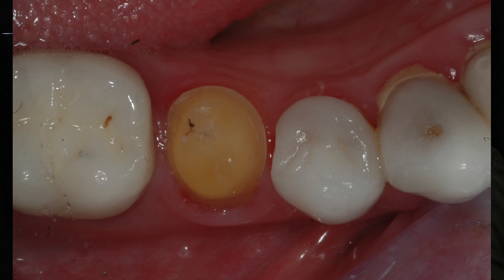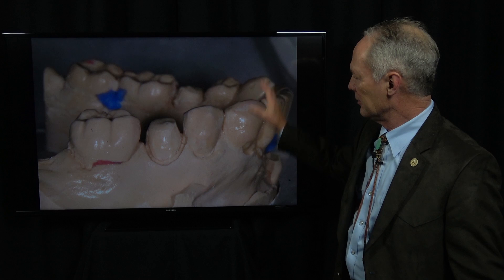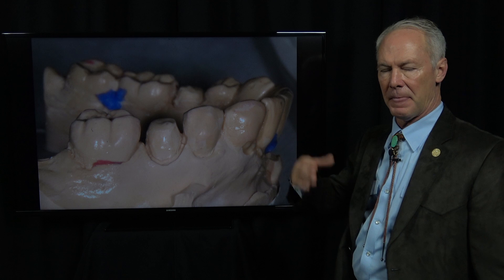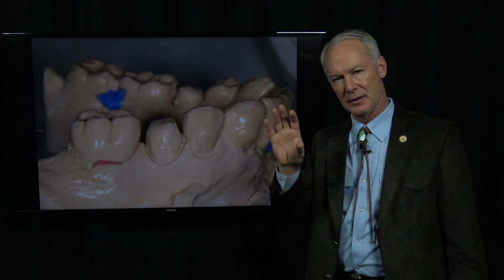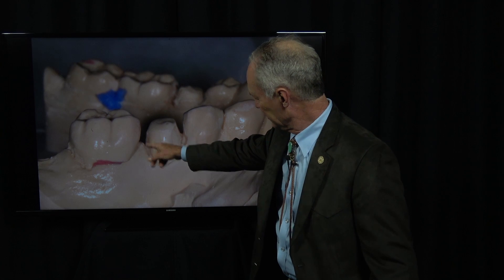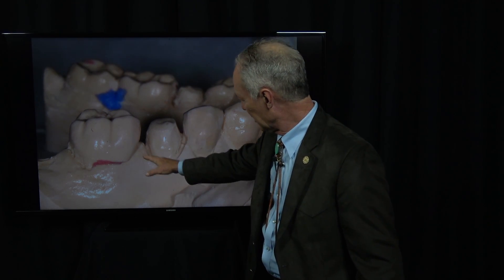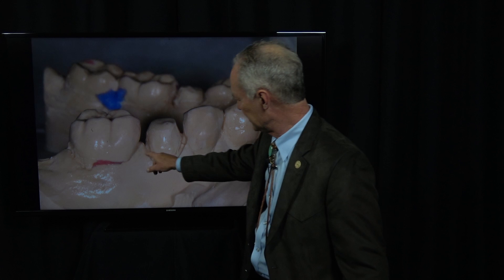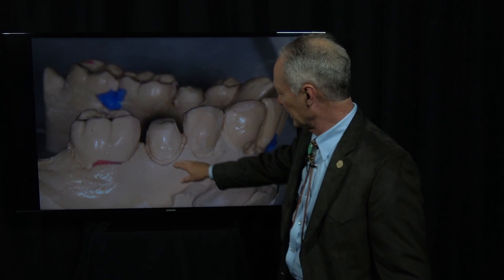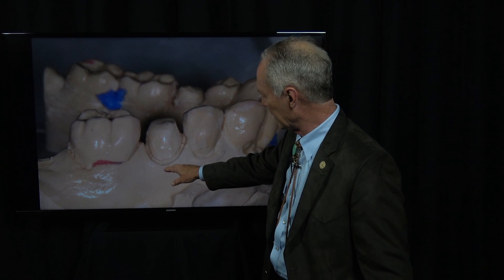We'll prep this tooth for a crown and this tooth for a crown. We've taken our impressions, our final impressions, and we've used one of the impressions to pour a die model. We're using another pour of the polyether impression material to pour a solid model. You can see how we've cut all the stone tissue part and the gingival one-fourth of the preparation away.